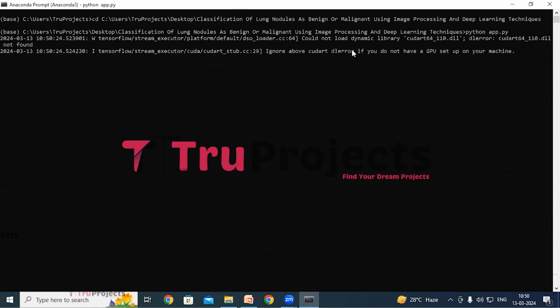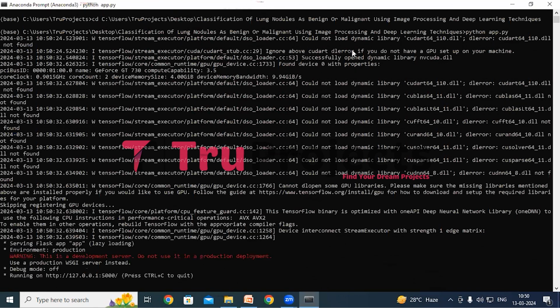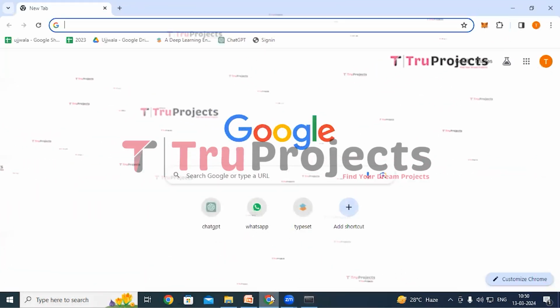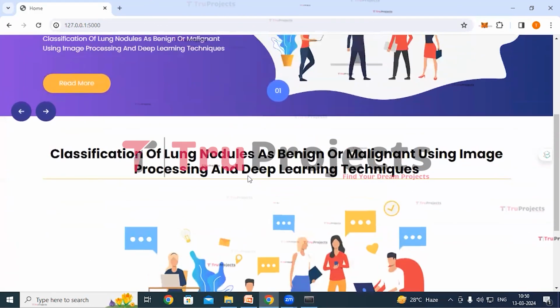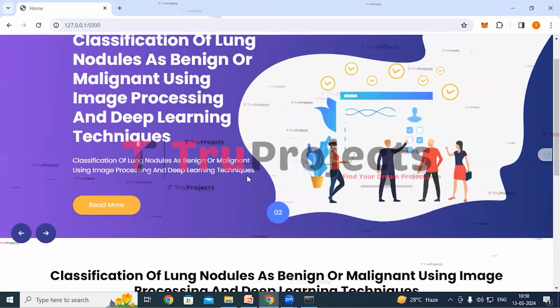After running the app.py file, the Flask framework will host the application locally at the default address, localhost, and port, unless configured differently. Now copy the local link provided by the framework. I'm copying it and paste it into any web browser. I prefer Chrome. After pasting it, hit the enter button. So the home page of the project has been displayed in the browser.